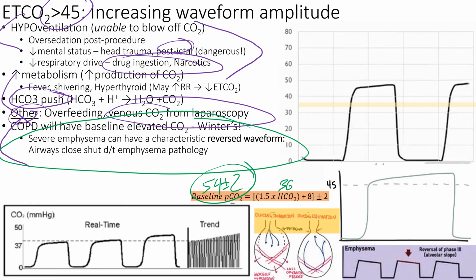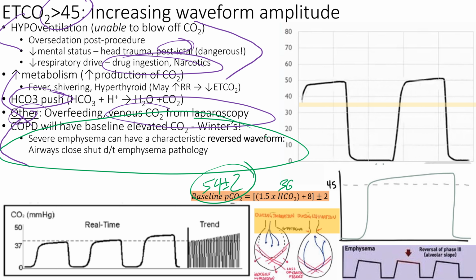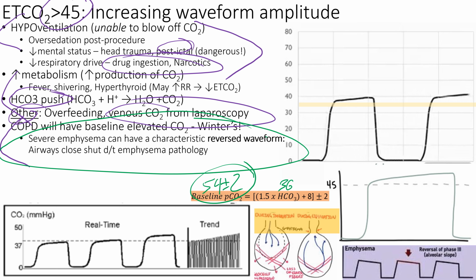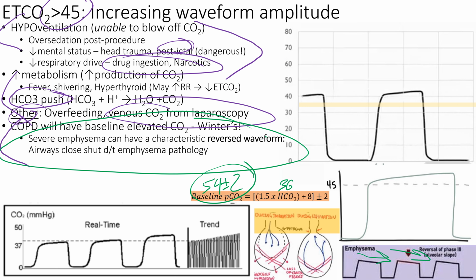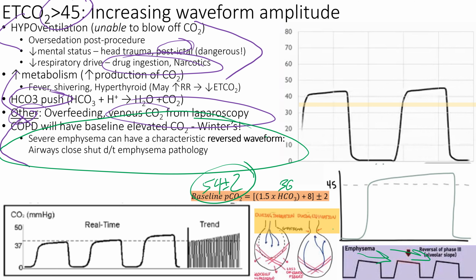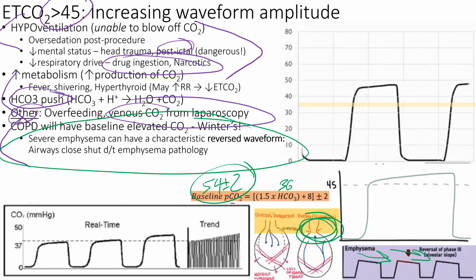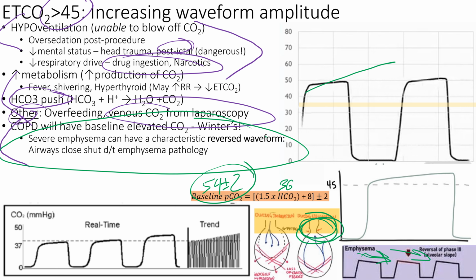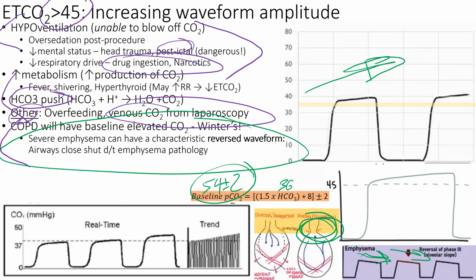And the danger is on the other side. If we think the CO2 is too low and correct it, they're going to stop breathing to compensate for the high bicarb, for the alkalosis. And your COPD patients, they have this emphysematous pattern, right? They exhale completely, and then their lungs collapse right there, right at the distal bronchus, and they trap the air for one, but also they can't get any further breath, right? We expect our end-tidal CO2 to kind of rise just a little bit.